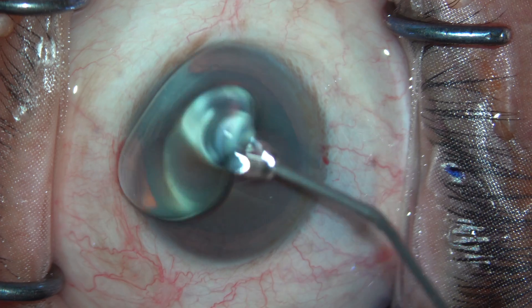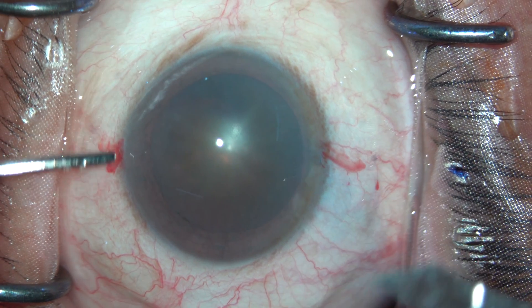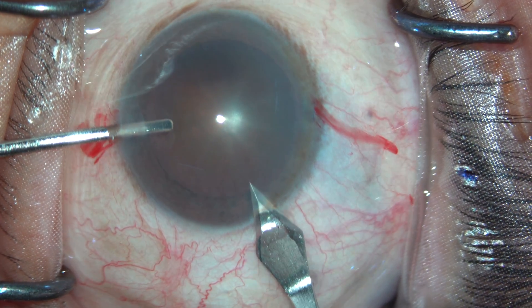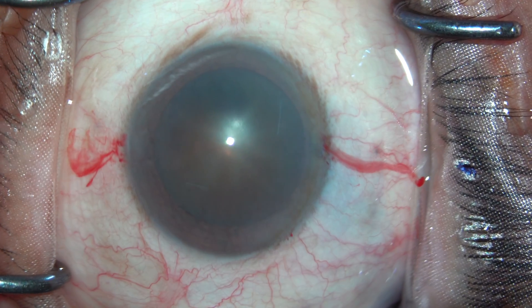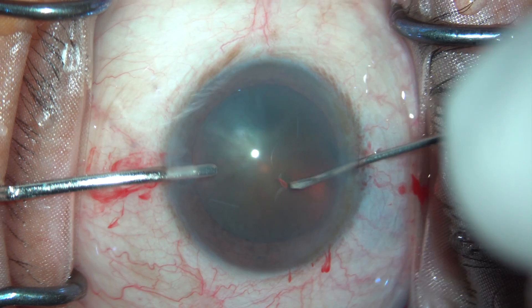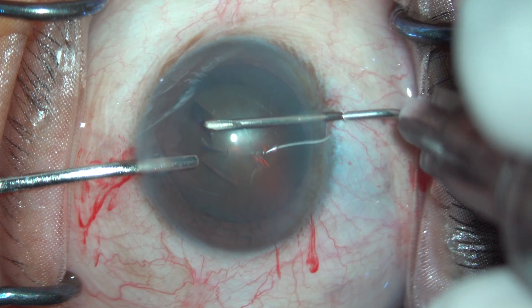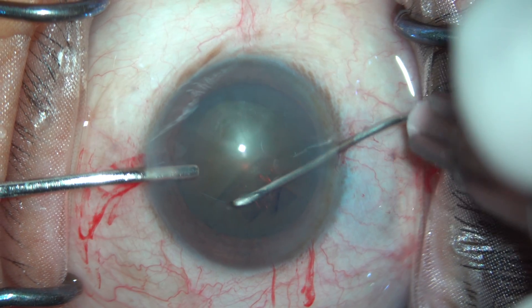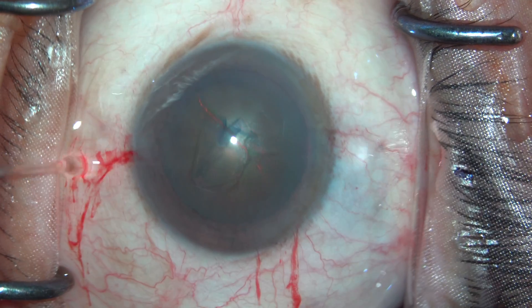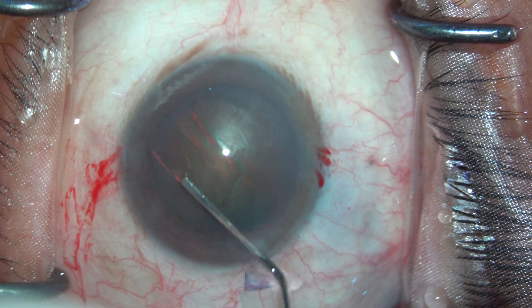HPMC is used and it is also coated on the surface of the cornea for better visibility, followed by a 2.8 mm incision which is the main port via keratome. Using a cystitome, CCC is started with a C pattern and this is fairly completed with ease.